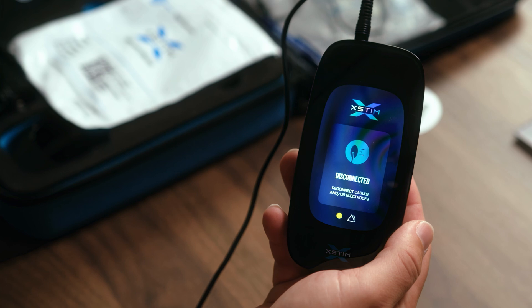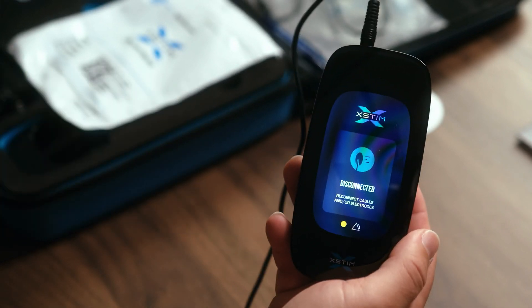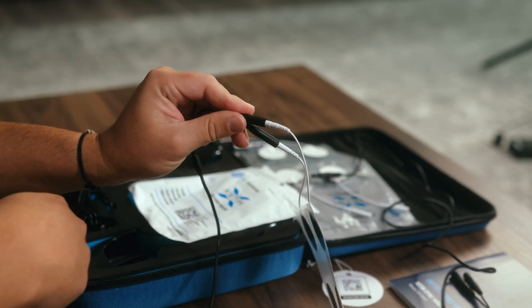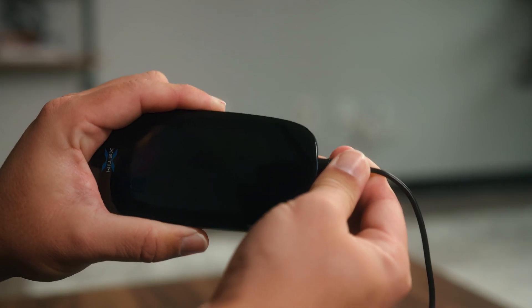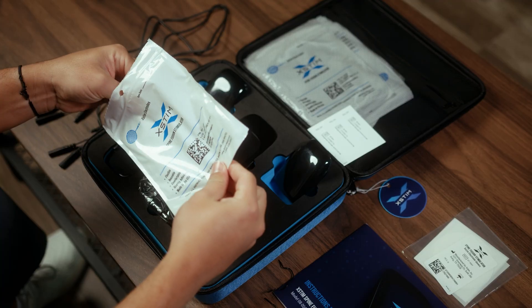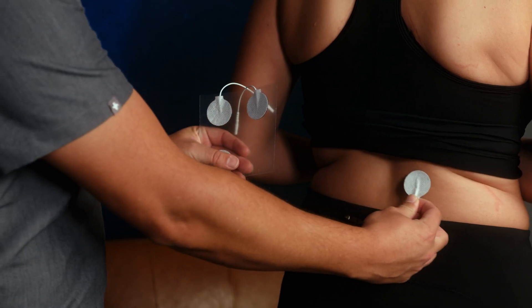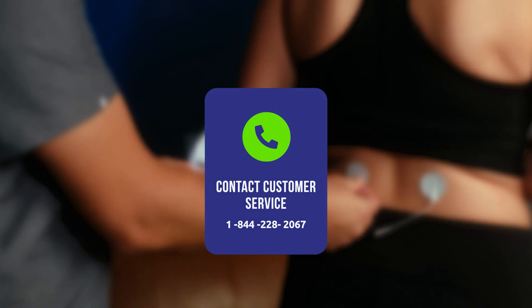If you encounter a disconnection notification, follow these troubleshooting steps: 1. Ensure the electrodes are securely attached to your skin. 2. Check that the electrode lead wires are firmly connected to the electrode or electrode cables. 3. Make sure the controller lead wire is properly inserted into the controller. If the electrodes are dry, moisten them with a few drops of water. If they are old, replace them with new ones from your kit. Ensure your skin is clean and dry before reapplying the electrodes. If the problem persists, contact customer service at 844-228-2067.